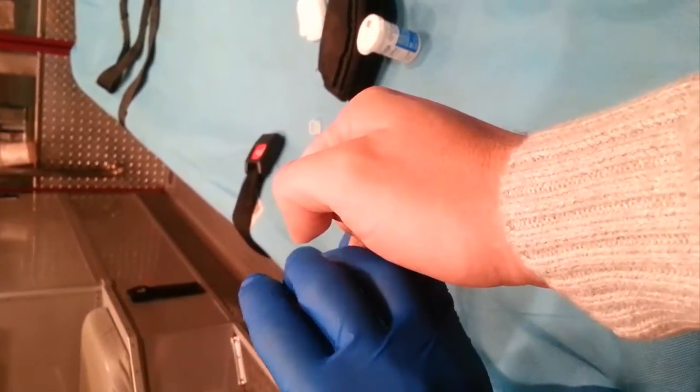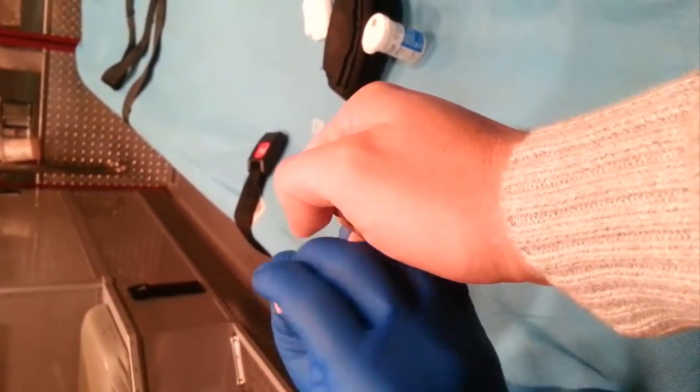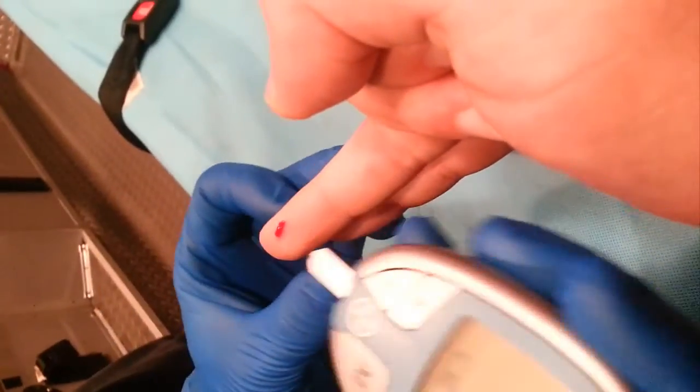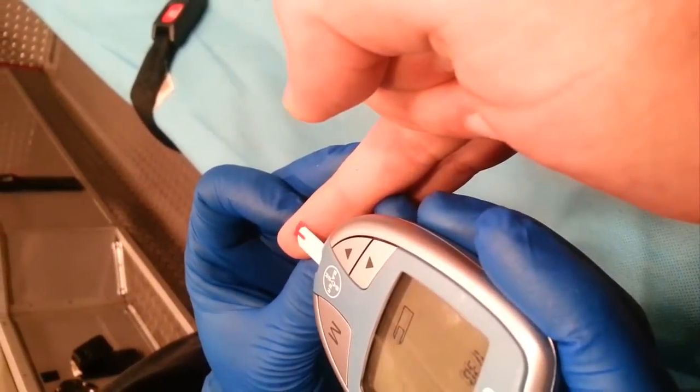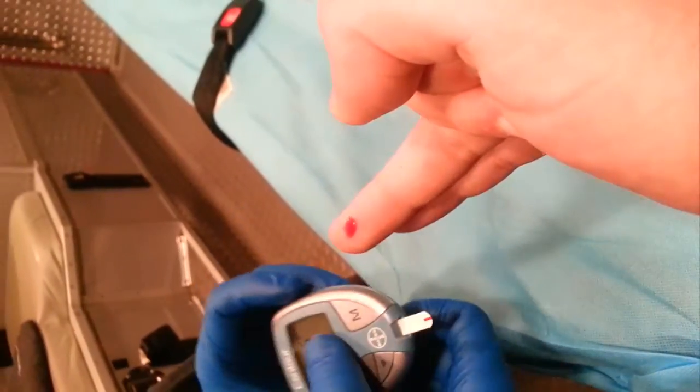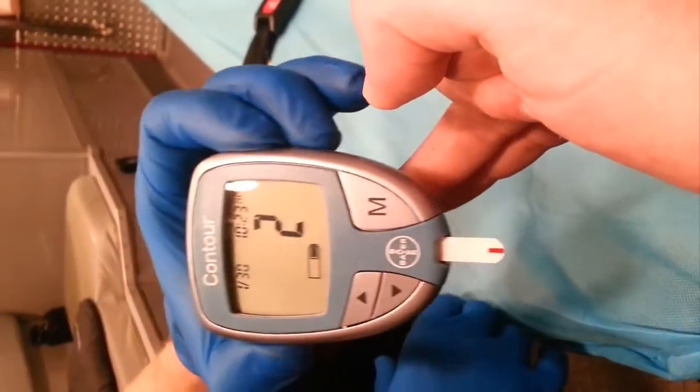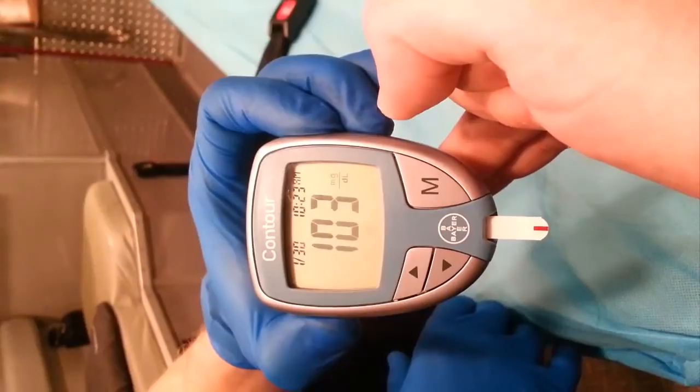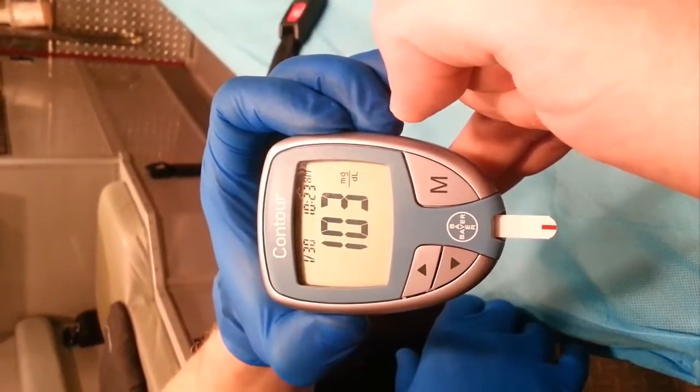So he swabbed for 30 seconds and now we're making the stick. And what we're going to get right here is going to be a dirty stick. That blood is contaminated. We're getting a reading that's going to show the sugar content in my own blood as well as the sugar in the alcohol that was used to prep the site. So we've got a reading of 103.